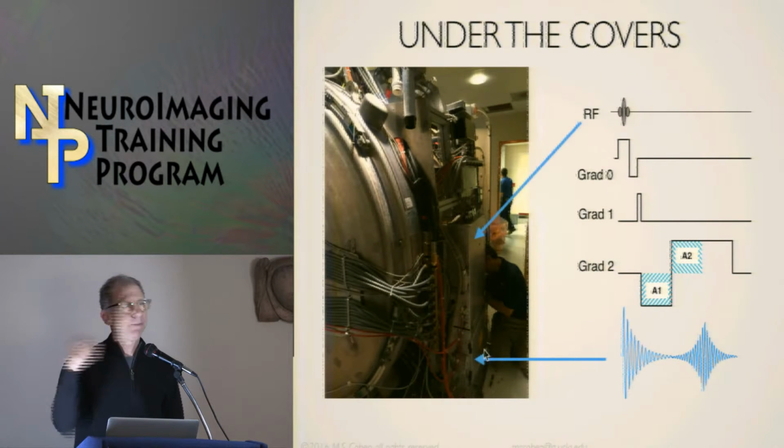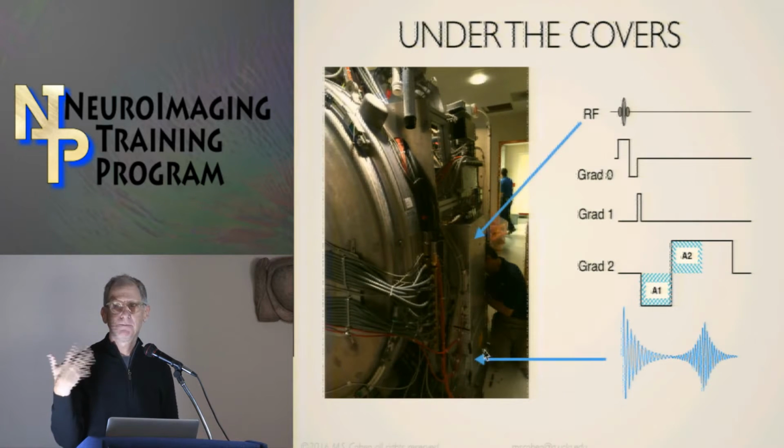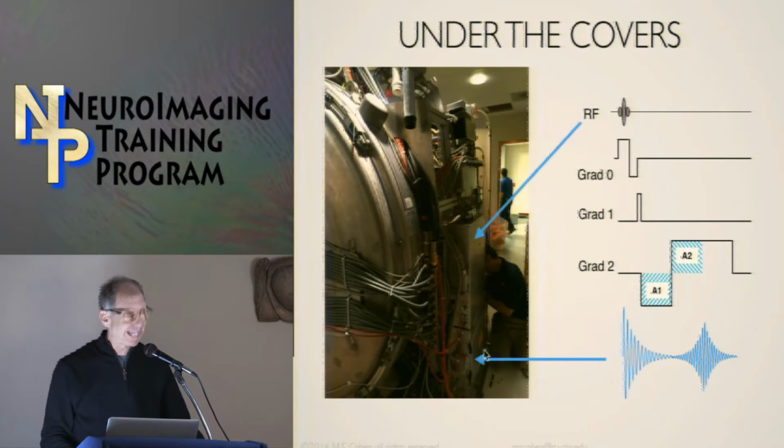and the data are digitized right at the scanner, and then communicated through optical fibers out of the scanner room. So there are no wires penetrating the walls. What that does is massively improve your signal-to-noise ratio on the scans. It's a very, very clever thing.